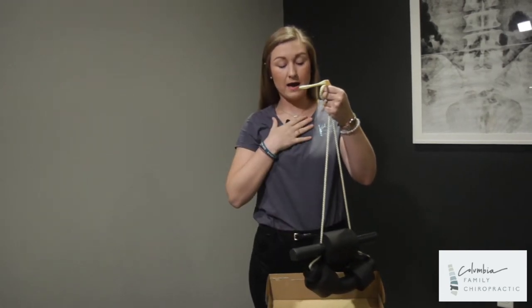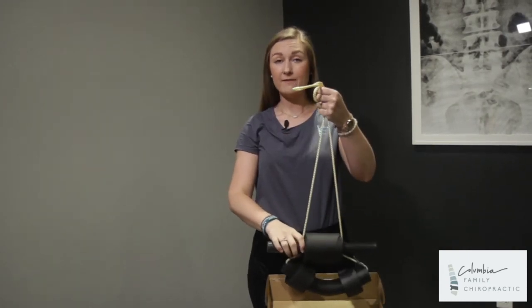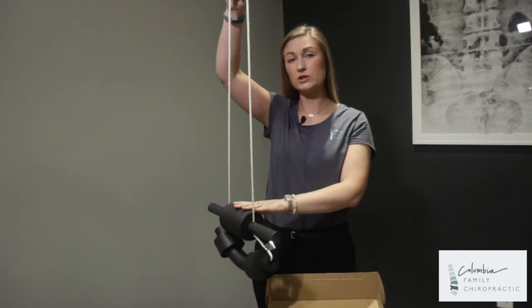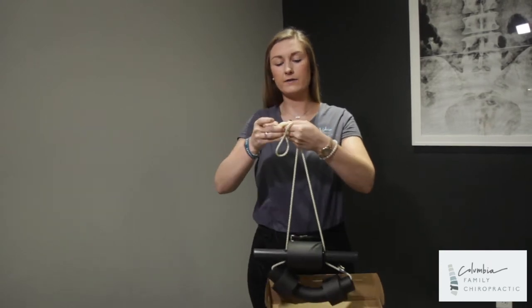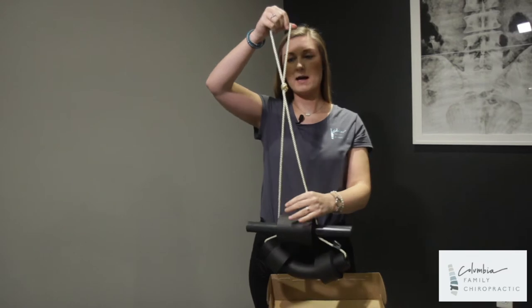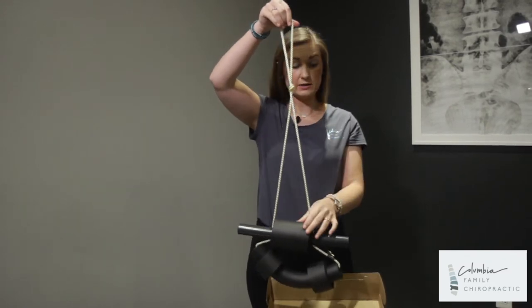I'm going to use this as though I'm setting it up for myself. I'm 5'7", so when I look at this traction unit it is going to be too low for me. I'm going to go ahead and tie some slack out of it. This part does not have to be exact — I'm just going to tie a good bit of slack out. I'll set this right here for a second and pull out the next part.